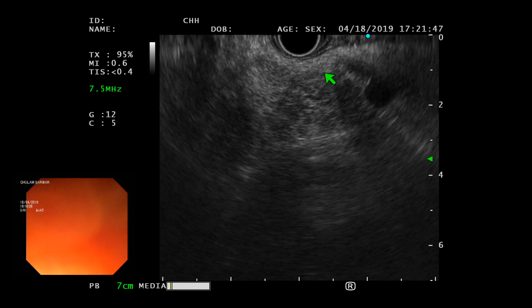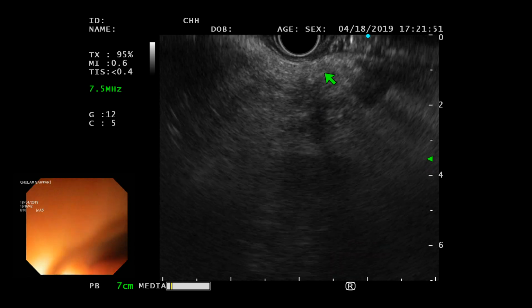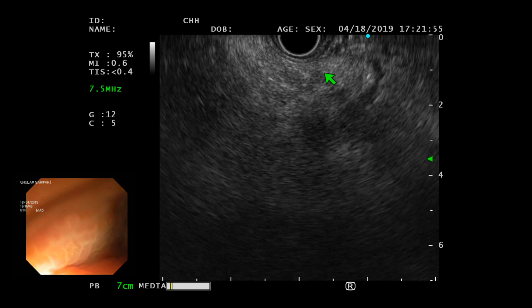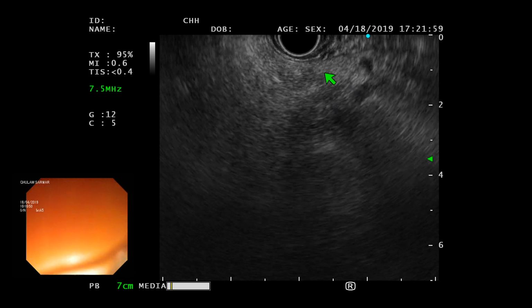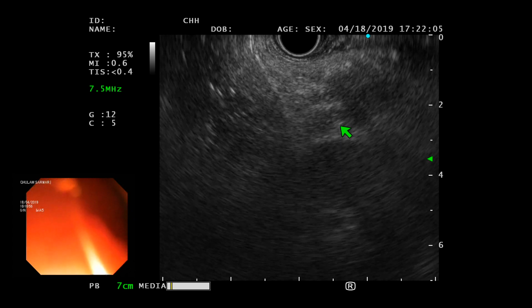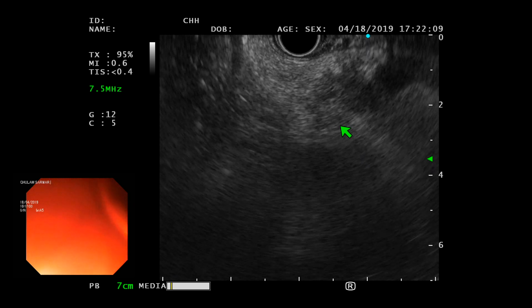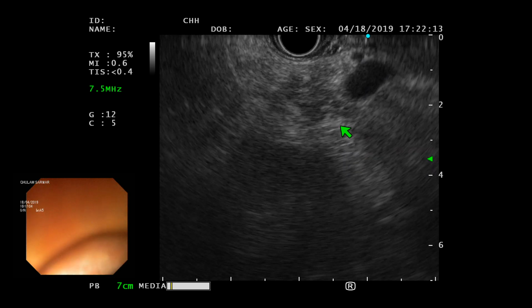Okay, keep it under the transducer. Keep going. Your pancreas is still under the transducer, and now the pancreas is going down. The neck is going down in this area. So the neck is falling down. Up, rotate. Up. Now it's going that way, right? What do you need to do? No, you need to pull the scope back and big wheel towards you. Right there. It comes underneath.